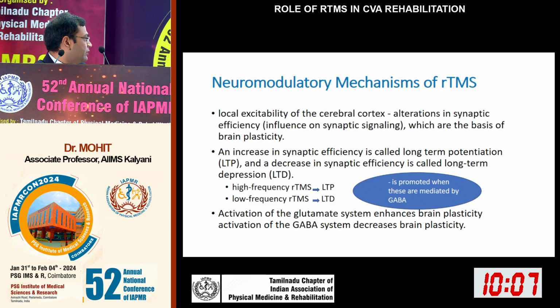If we use high frequency RTMS, it causes long-term potentiation, and on the other hand, if we use low frequency, it causes long-term depression. This is mediated by GABA. Activation of the glutamate system enhances brain plasticity, and activation of GABA decreases brain plasticity.